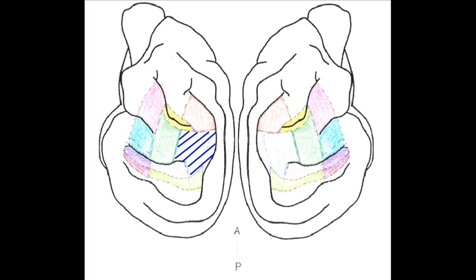Then the left hemisphere cryoloops were turned on so that the loops reached a temperature of 3 degrees Celsius plus or minus 1, and task performance was recorded. While the left loops were on, right hemisphere loops were also activated so that both loops were on while the cats oriented themselves toward the sound stimuli. After this, the left loops were turned off while the right ones remained on. Then the right loops were turned off so that both were off, so the brain could equilibrate back to 37 degrees Celsius and orienting responses could be measured at baseline after recovering from cooling. This cycle was repeated several times for each cat, but also in reverse order of baseline, right, both, left, baseline.